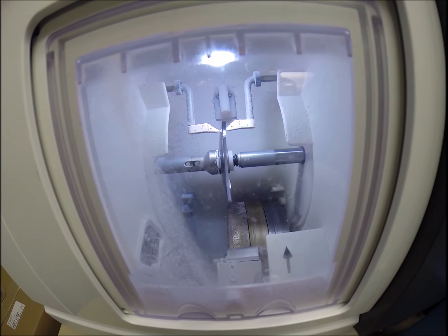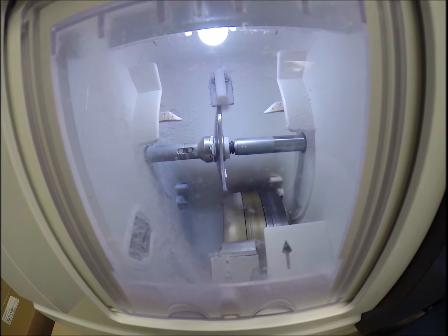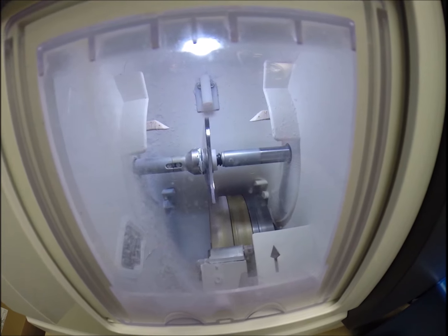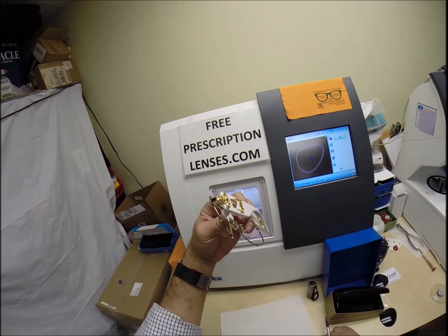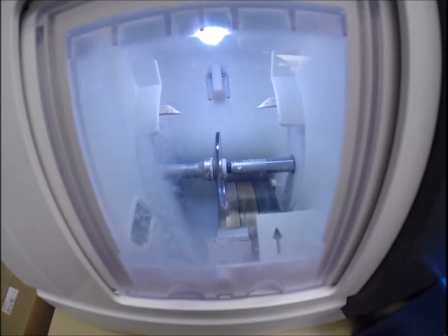It's measuring the thickness of the lens at every point to know exactly and precisely where to place the bevel, so you have the least amount of edge thickness showing, of which in this frame with your prescription you're hardly going to have any. Even in a thin metal frame, the worst shape for edge thickness is a large frame, a large metal frame, a large skinny metal frame on top of that, but you shouldn't really have any in this frame.